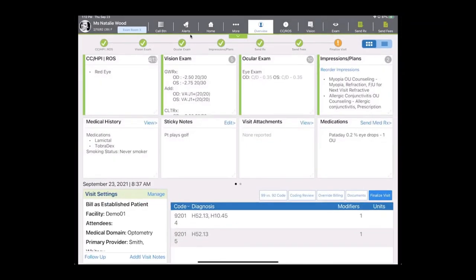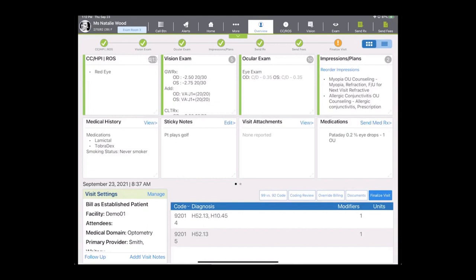Once you've completed your items in the ocular exam room, you'll notice that the impressions and plans will auto-populate for you and billing and coding will auto-populate as well. The only thing left to do is to send the fees over to the practice management system and finalize the visit. Most of our doctors, because of the nature of importing the data as you move along throughout the visit, are able to finalize visits right in the exam lane, which leaves a lot more time at the end of the day and to not pour over charts.